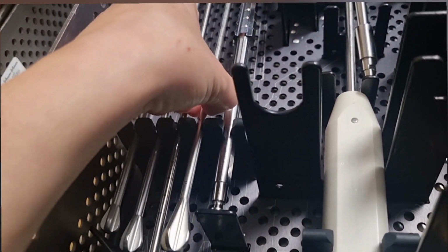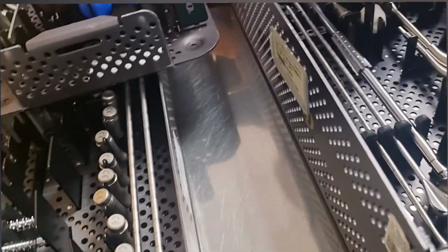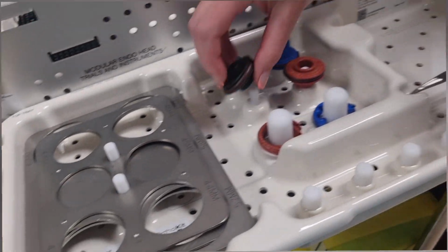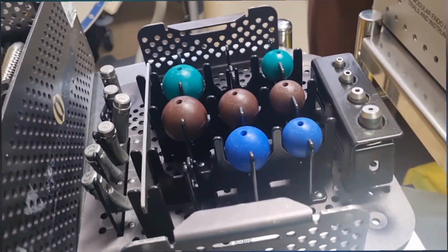This one is to measure the centralizer. They're usually a 10 or 12. 10, 12, 14. So yes, we need all of this, plus the basic trays for soft tissue, and retractors, and the blades, and the scissors.